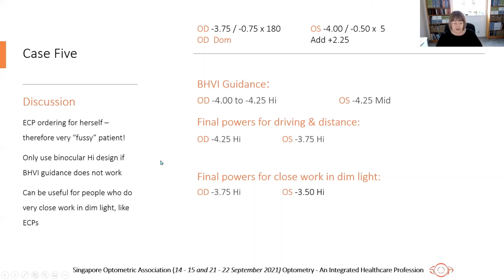So the take-home message from these cases is always start with your guidance, always make sure you've got a proper best sphere adjusted to what the patient wants, and then adjust if the patient has specific requirements for driving or for near.